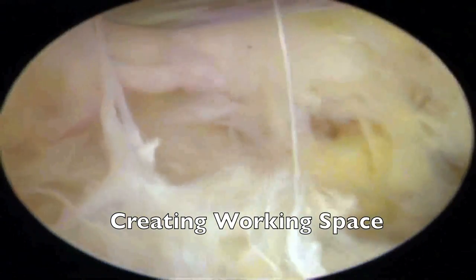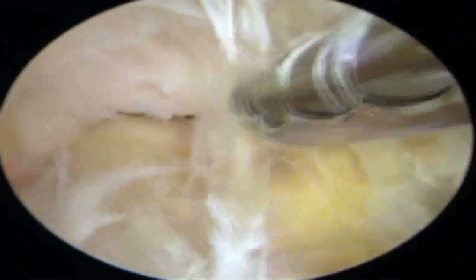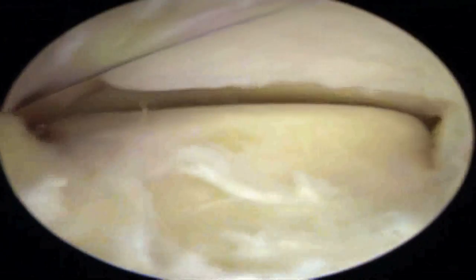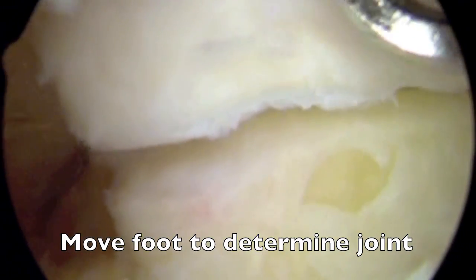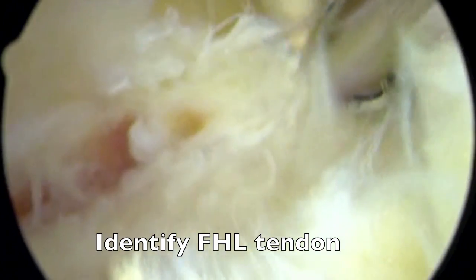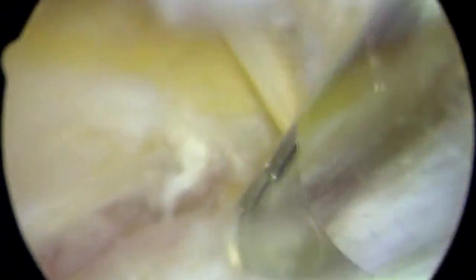In this video of hindfoot and posterior ankle arthroscopy, this minimally invasive procedure is performed through two small portals or incisions, which are approximately the size of an eyelash. The landmarks within this surgical area are first identified to maintain orientation, including the joints — the ankle and subtalar joints themselves — and the flexor hallucis longus, or FHL, tendon. Because both the ankle and subtalar joints come together in the back of the ankle and foot within a space of less than half an inch, the back of both joints can be easily identified and treated as needed.